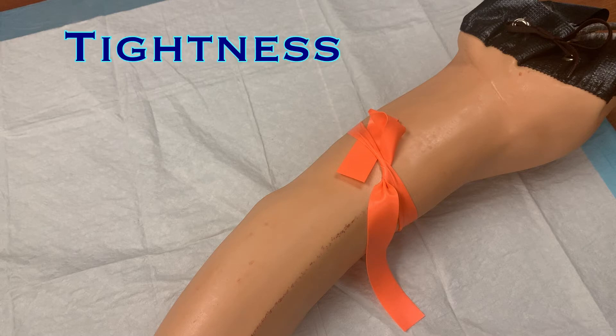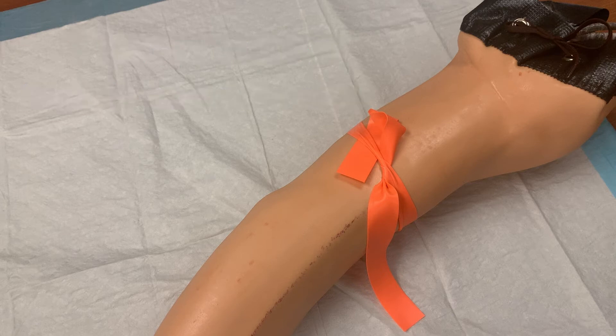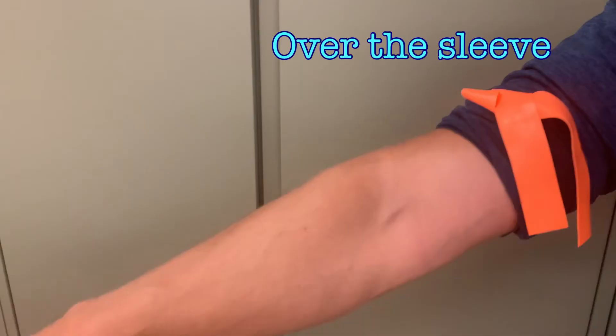The tourniquet should be tight — not so tight as to cause pain, but it should be slightly uncomfortable. If they can't feel it, it probably isn't doing its job. It is acceptable to tie the tourniquet over the sleeve of the gown so that the rubber material doesn't pinch the skin, but this is clinician and patient preference.